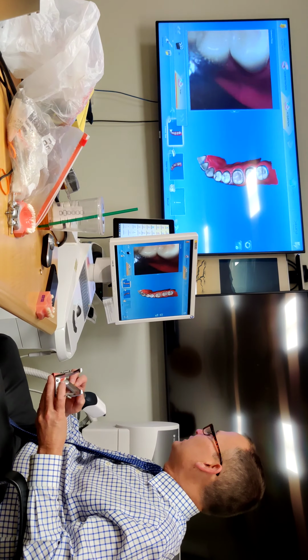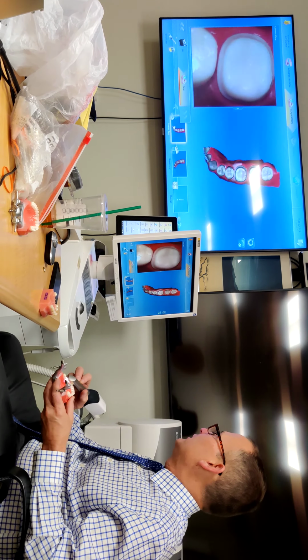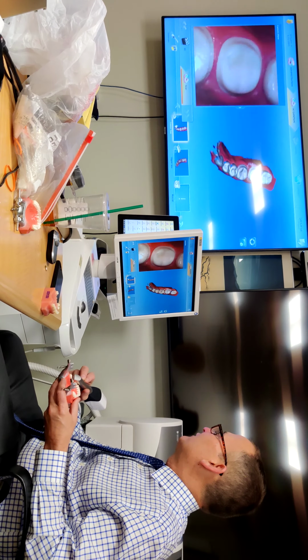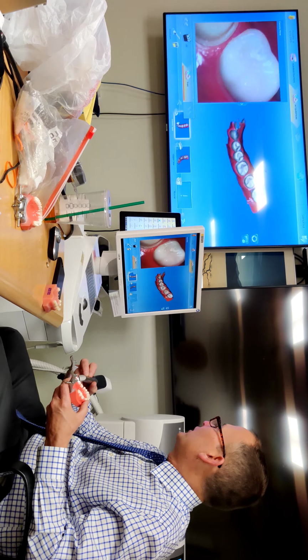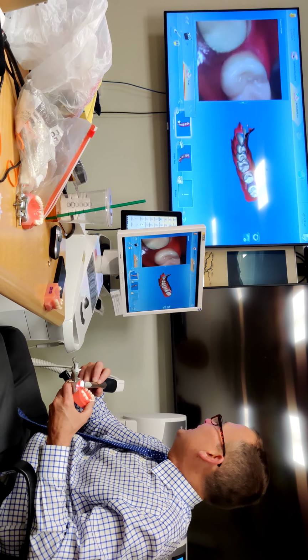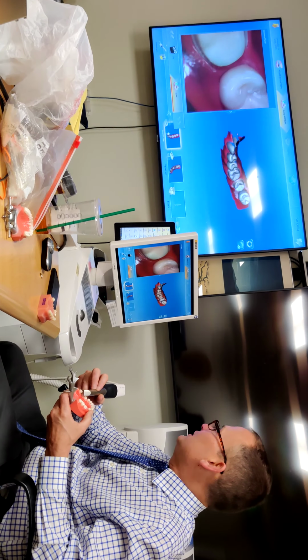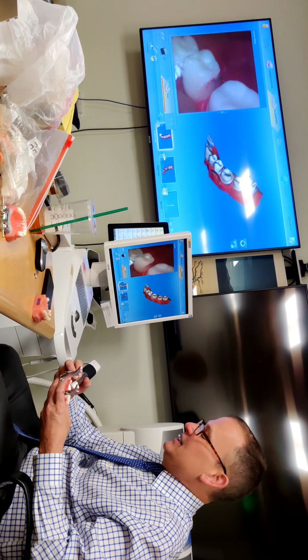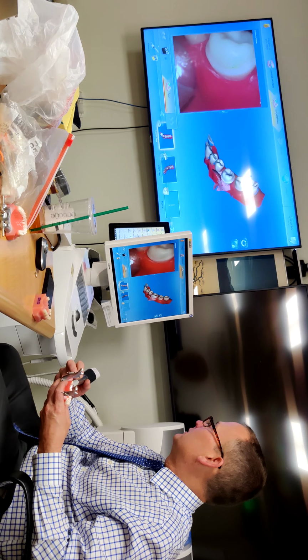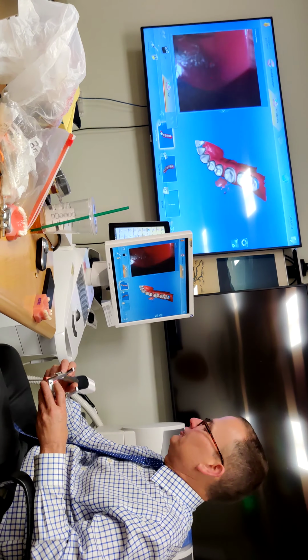Now I don't need to get these because I'm not doing these crowns, but I can. See, I do that little trick, and then look under the contact and get this. Also, I can turn the camera into the patient's cheek and look like that. Do you see? I just got it. But do you see what I had to do? I had to turn it into their cheek and point, get back there. So I got enough there to be able to do this crown.